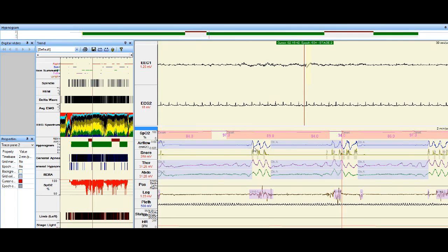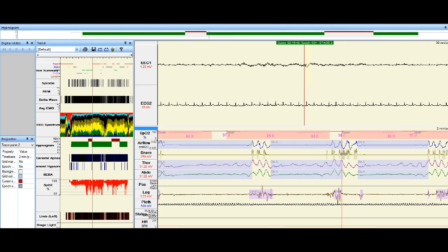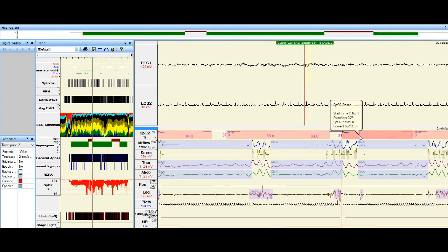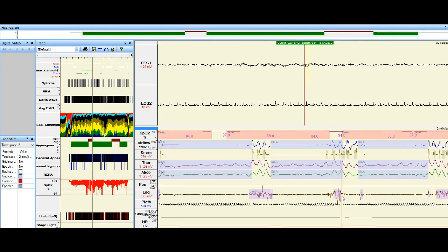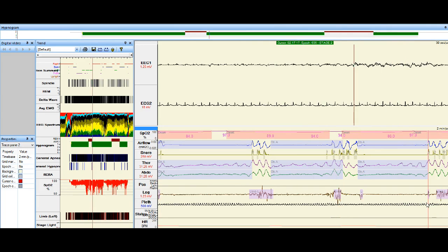No breath, and then some breathing, and then no breathing, and then a bit of breathing, no breathing, a bit of breathing. And we can actually mark all these parts where there's no breathing. And then the computer can actually analyze what we've marked. And that's how we generate a sleep study report. So this is the raw data you're looking at. You're getting to peer into the raw data.